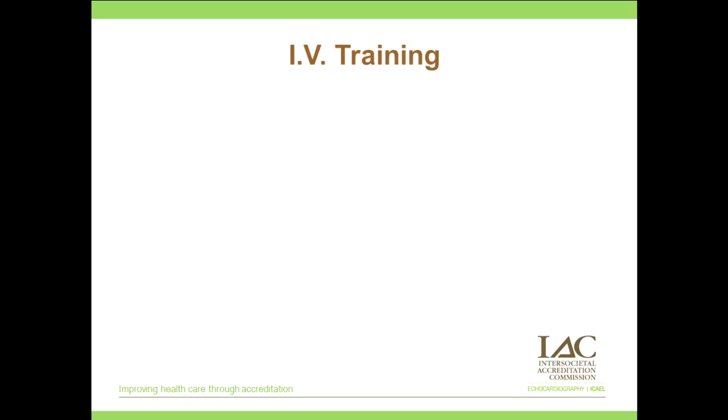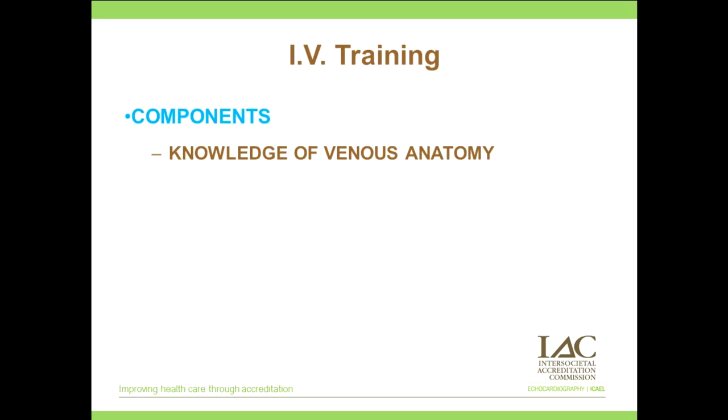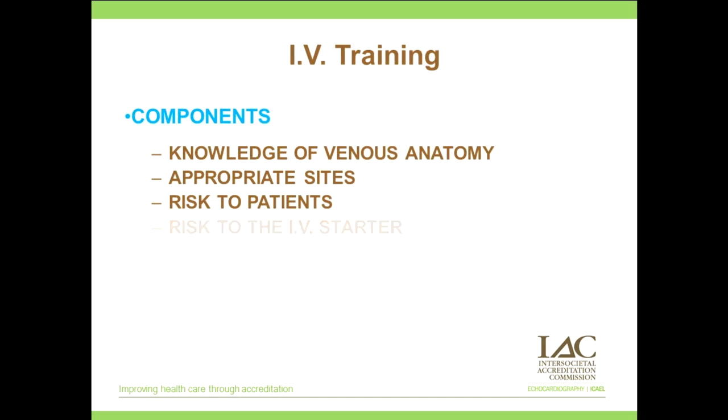Okay, so let's briefly talk about IV training. Let's say the sonographers want to become trained. So we're going to go over some components for IV training. These include but are not limited to knowledge of venous anatomy, what sites do we use, the risks to the patient, such as infection. Are there risks to the IV starter?